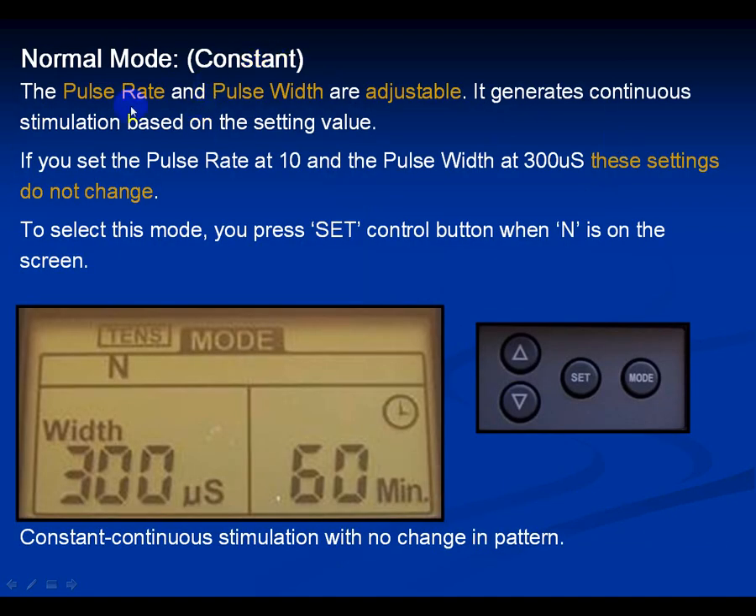Normal mode or constant: the pulse rate and pulse width are adjustable but, once set, they don't change. If you select a pulse width of 300, it stays at 300; if pulse rate is at 10, it stays at 10. The constant mode is also the mode you might use as muscle stimulation to fatigue muscle spasms — placing two pads on a spasming muscle, turning it up, and contracting it for 10 minutes until the muscle exhausts and quits spasming.